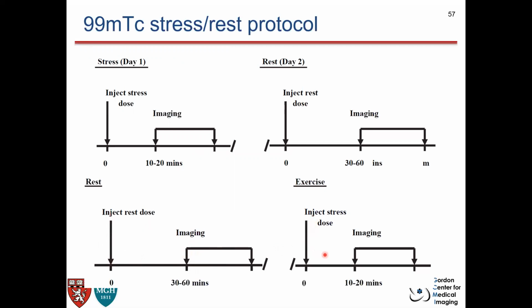Of course, it can't be a larger dose. It can't be too much dose. And then you start the acquisition again to finish the scan of the patient within the same day. So as I mentioned before, if you're doing a single day acquisition, you can't inject the patient with much dose. So this was just an example.